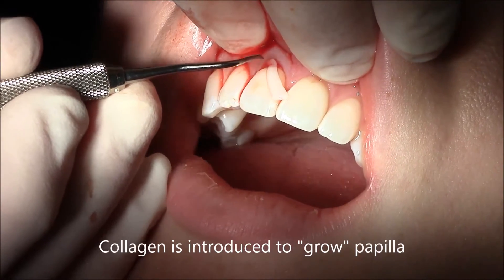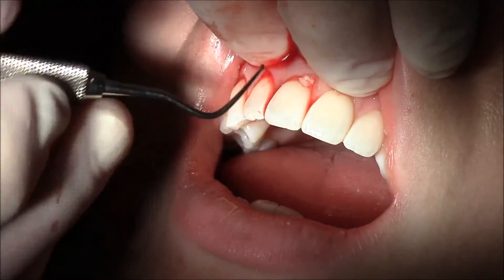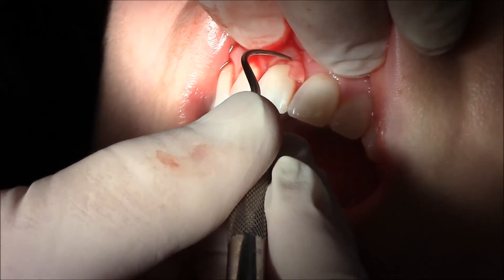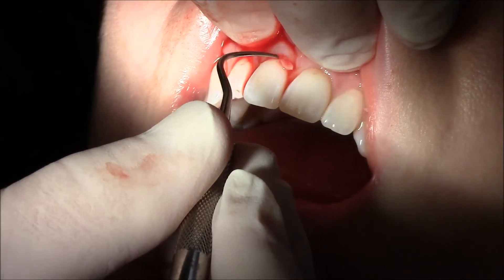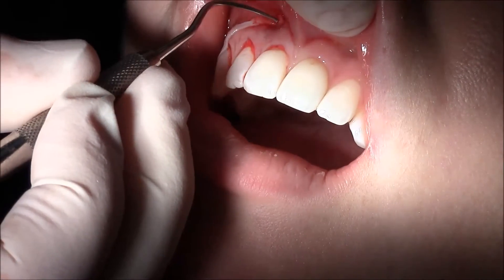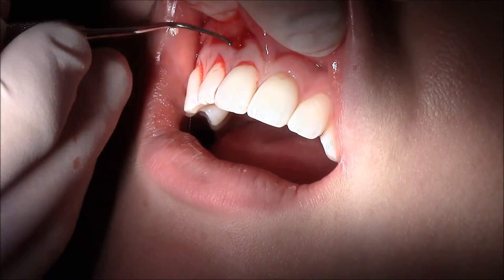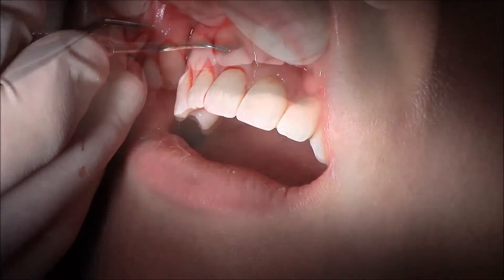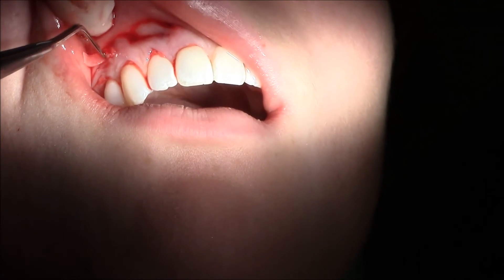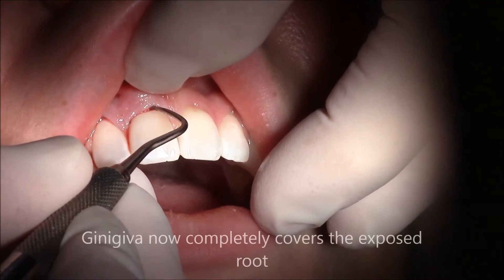Now watch how I use this modified spoon again — I repack it from the other direction — and now how thick and beautiful and back to normal that gum tissue is, plumped back up. We do a lot of it from above through those little pinholes, threading it down into the papilla area. See how all that root is being completely covered as we pack down in between the canine and the first premolar, and carefully make sure it's all covered on the incisor. You can see the gingiva is completely covering all the exposed root.